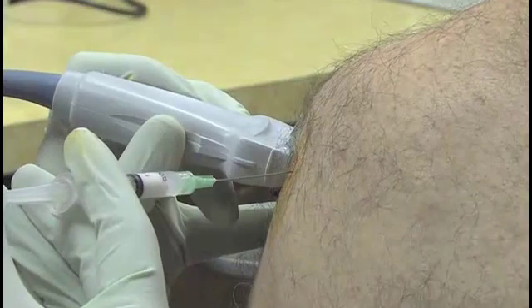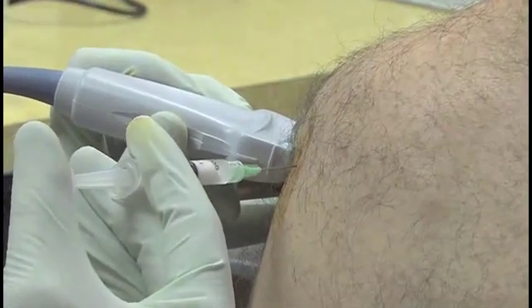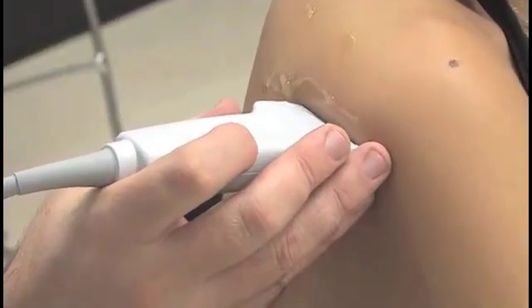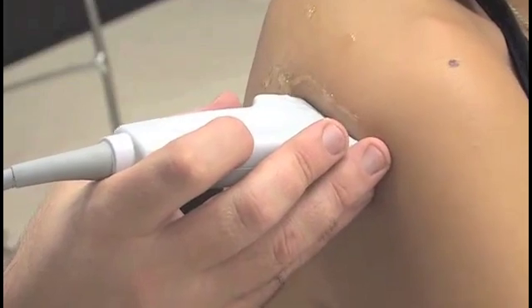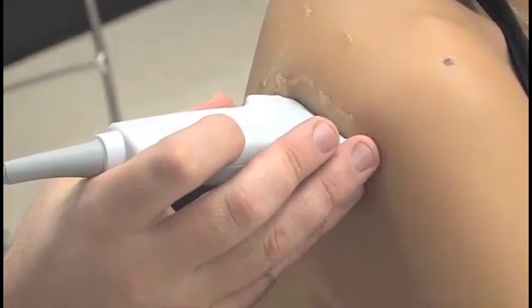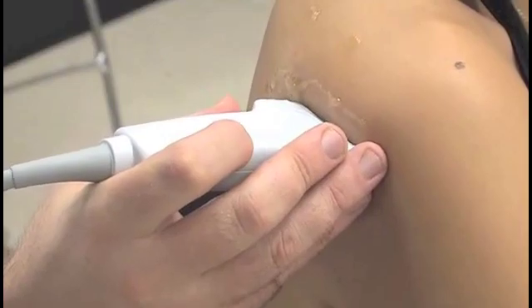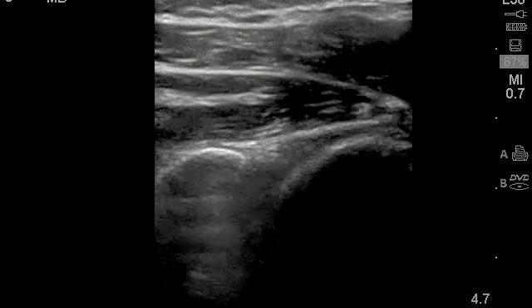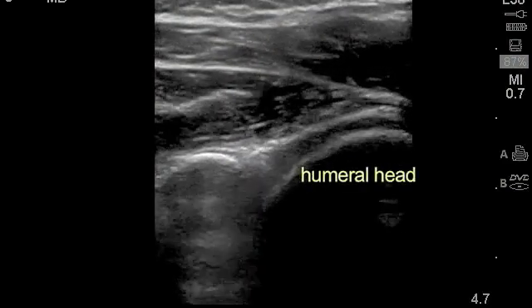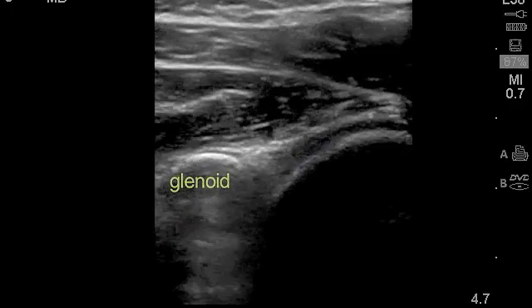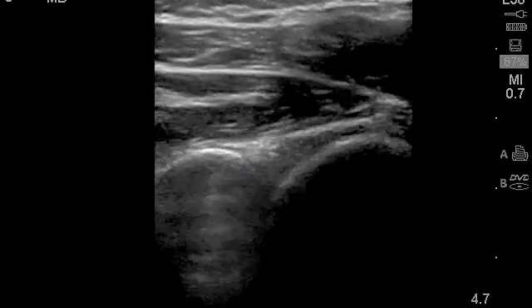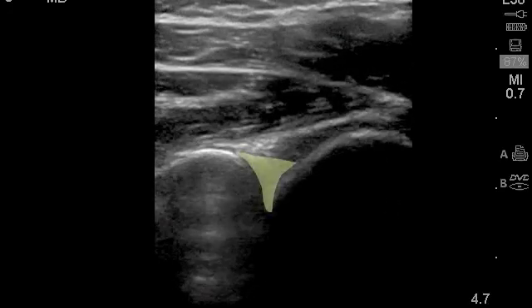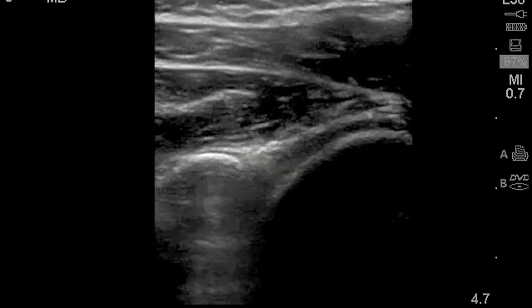Injection of the glenohumeral joint may be preferred in cases of osteoarthritis, rheumatoid arthritis, or adhesive capsulitis. In the posterior approach, the patient should be seated with the ipsilateral hand resting on the opposite shoulder. The high-frequency probe is placed just below the acromion and roughly parallel to the spine of the scapula. If the directional indicator is to the patient's left, the curved cortex of the humeral head will be seen on the right side of the ultrasound screen and the flat cortex of the glenoid on the left. Movement of the humeral head may help confirm the anatomy. The hypoechoic space between the glenoid and the humeral head represents the joint space and is the target for injection.